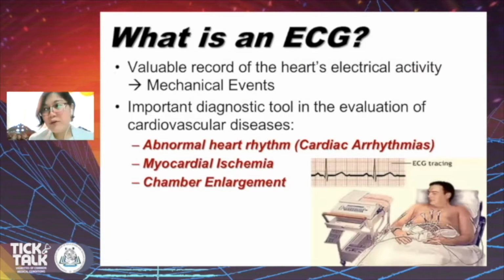We will have to remember that the ECG has been around for quite a long time already. It is one of the most economical diagnostic tools that we have, the most readily available, and one of the easiest to do. So I guess everyone would have to at least have a basic knowledge of how to interpret and recognize important ECG tracings.